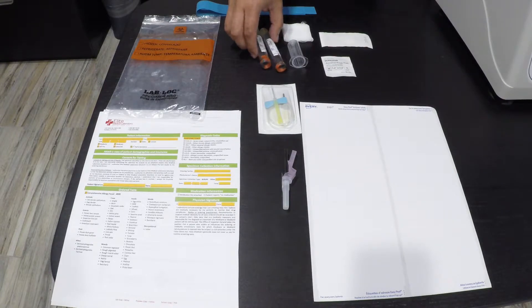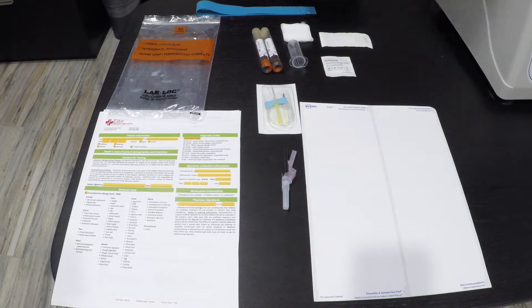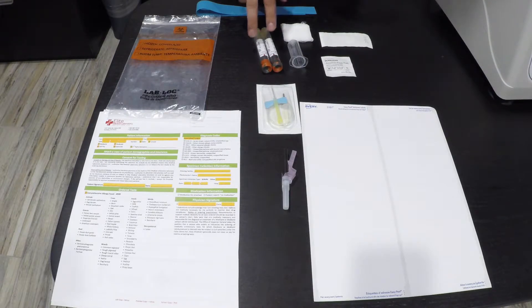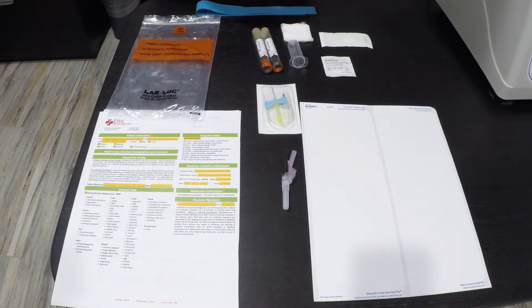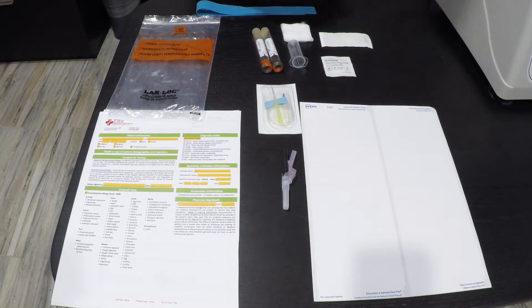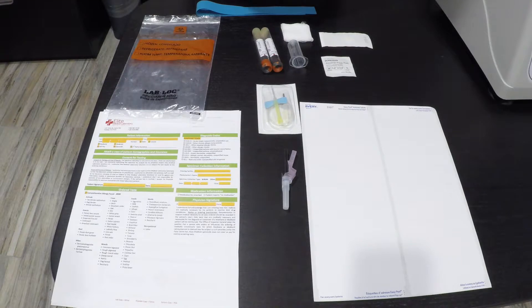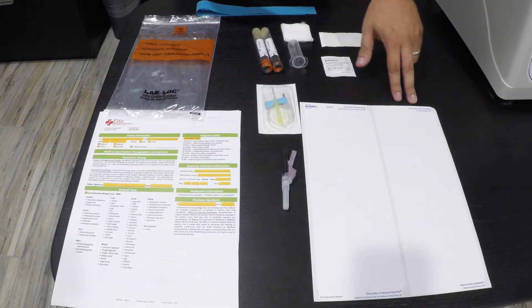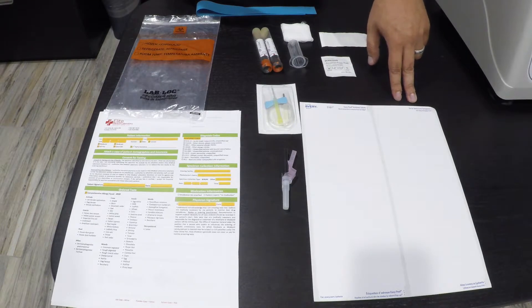In order to process the allergy panel, the MA will need to collect blood for 2 tiger tops. The 2 tiger tops must be labeled correctly with the patient's name, date of birth, time, and date of collection. Labels will be provided.